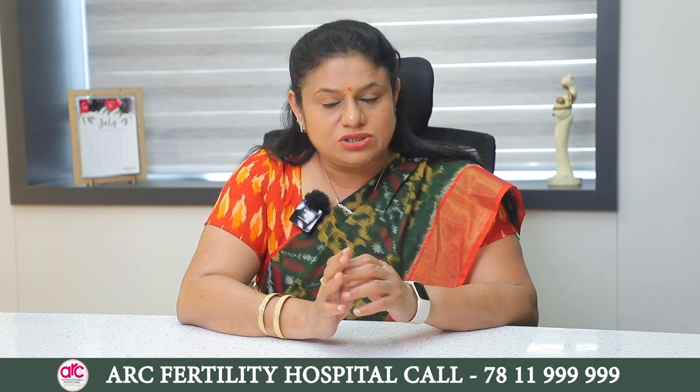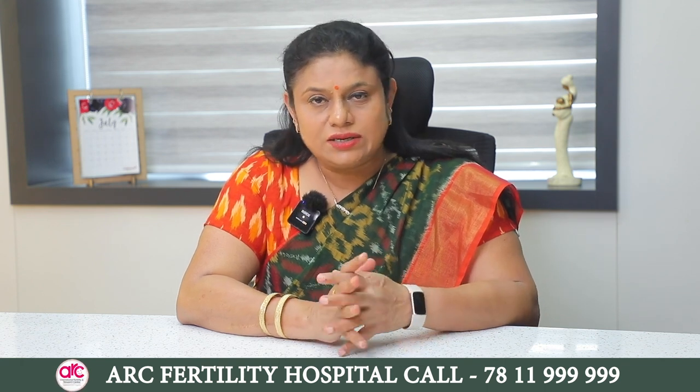By doing this procedure, we will be able to assess the size of the uterine cavity, the adequacy of the uterine cavity, and whether there is any presence of septum, polyp or any intrauterine adhesions inside the uterine cavity. If any, it's better to treat the cause.